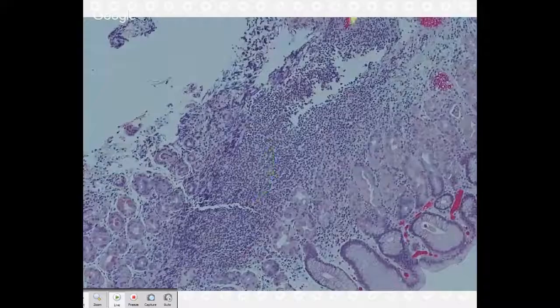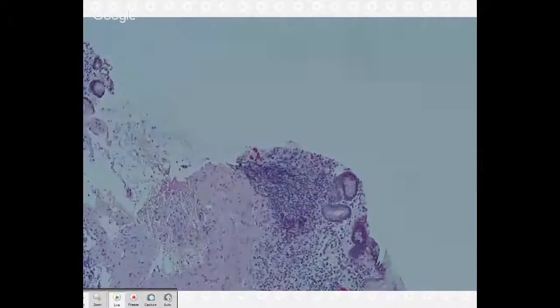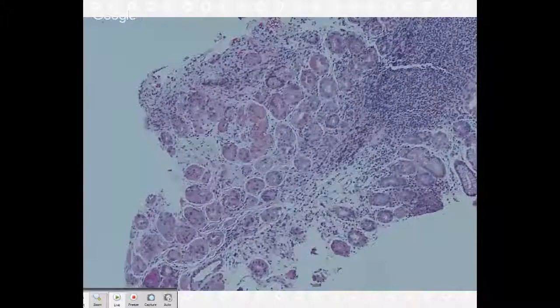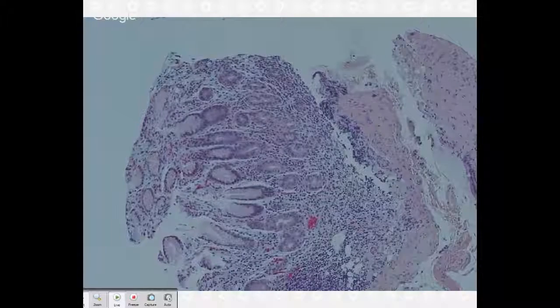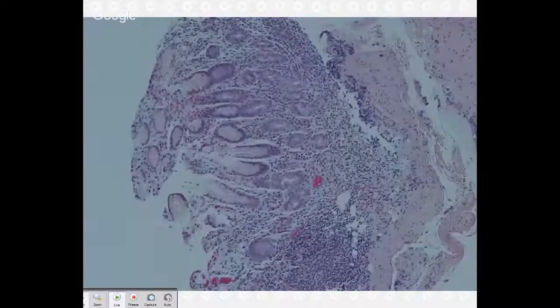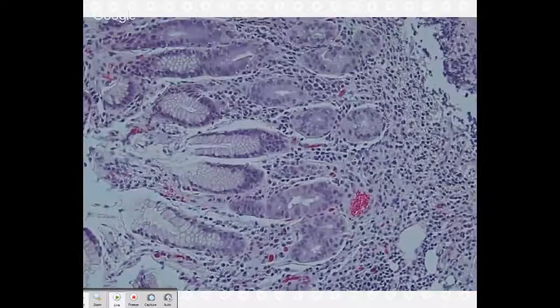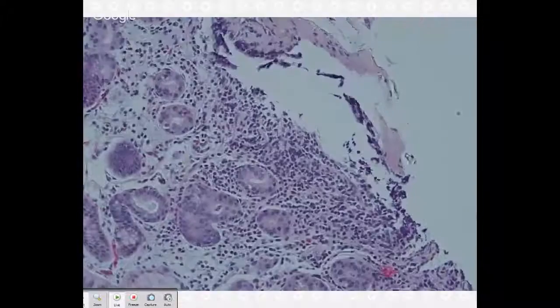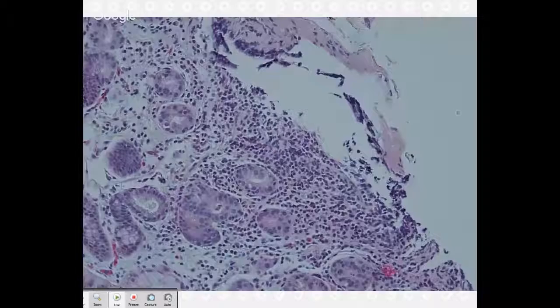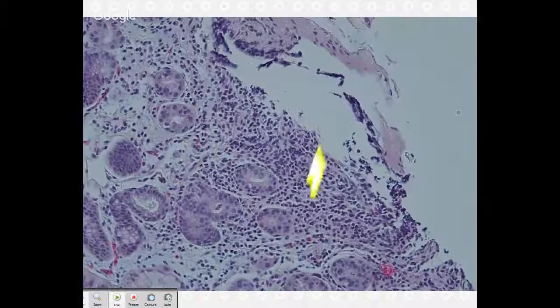So there are some small nodular areas of inflammatory cells. Like here, it's really dense. This is more dense. And there are some small foci here and there. Here it's quite inflamed. They look mostly lymphoid cells. I don't want to say lymphocytes directly, but it looks very lymphoid and monotonous to me. In some areas there are admixed plasma cells, and there are some eosinophils here and there.